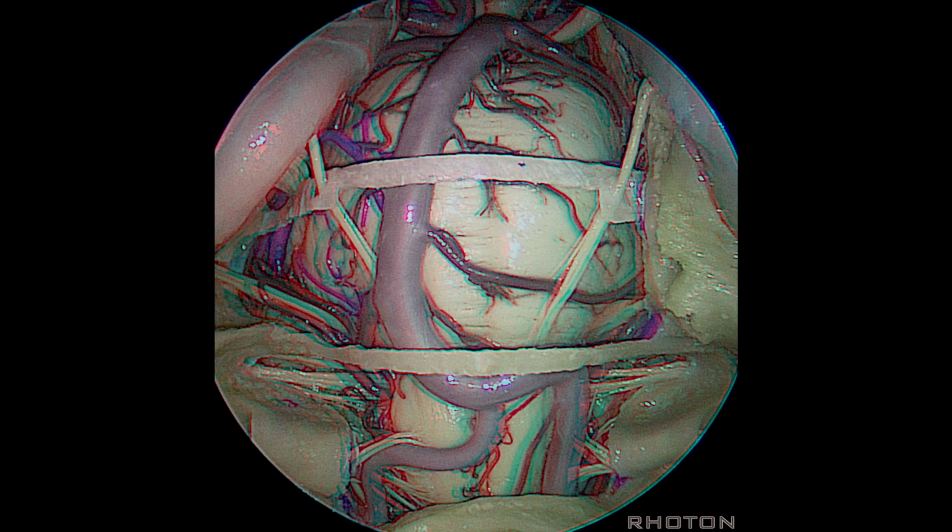But we see 6 nerves entering the dura here. You can drill off this petrous apex area. You can get in with an angled endoscope and work laterally to 7 and 8. Here, both 6 nerves at dural exit.